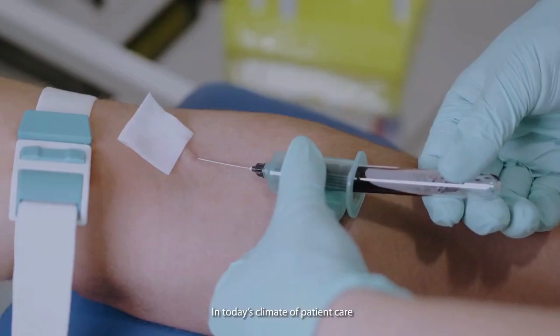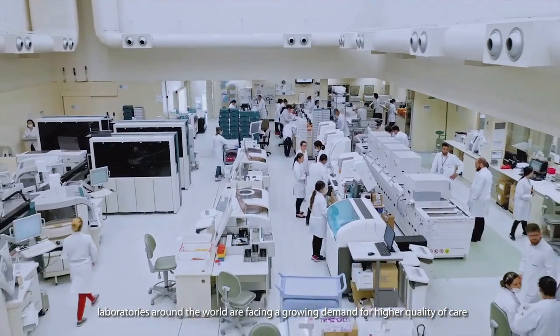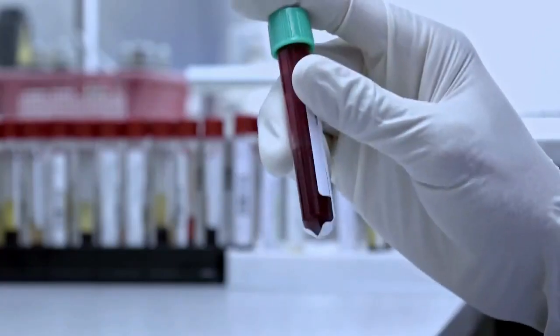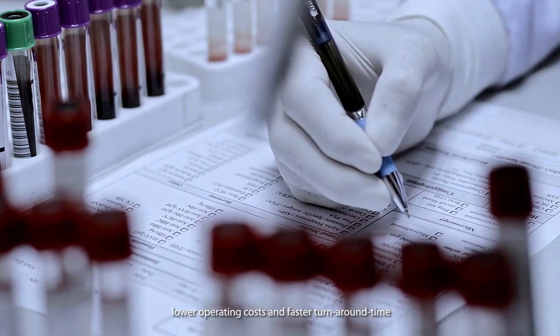In today's climate of patient care, laboratories around the world are facing a growing demand for higher quality of care, lower operating costs, and faster turnaround time.